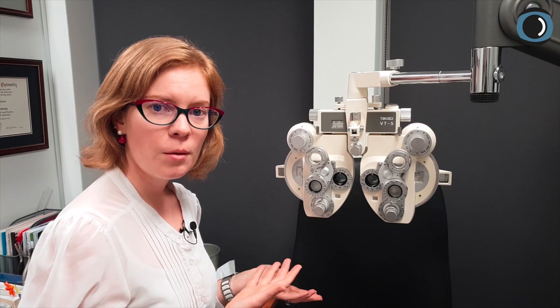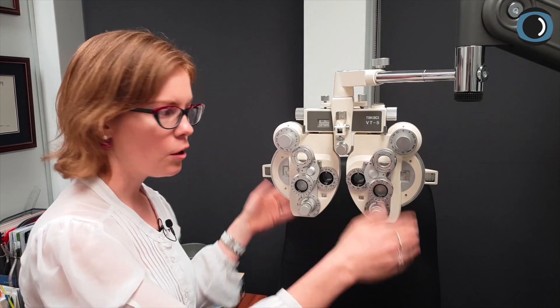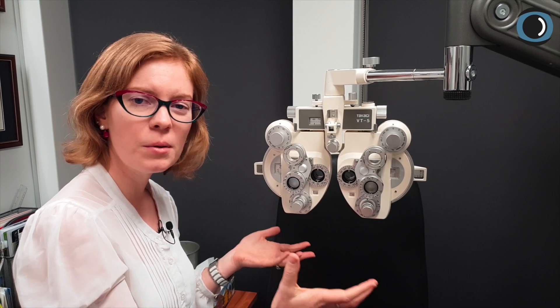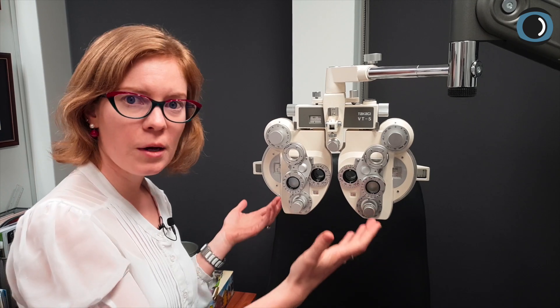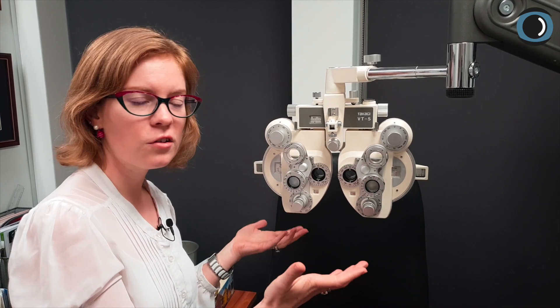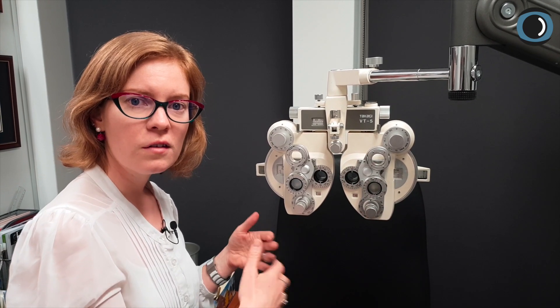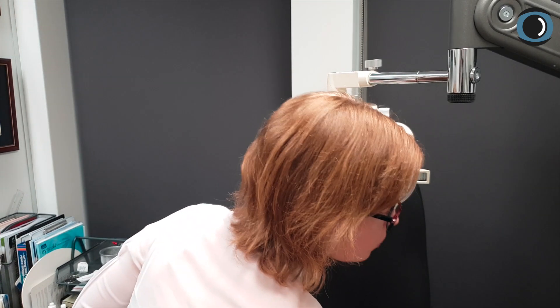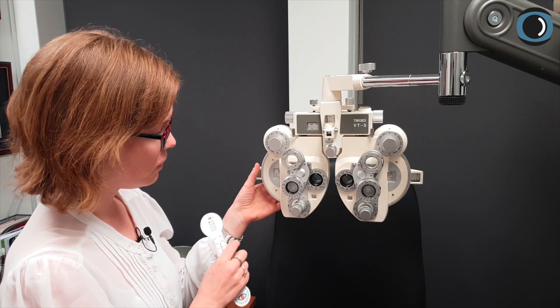Other binocular balance techniques might ask you to blur the patient by plus 0.50 and then ask them to find a difference where there may not be one. You've worked hard on this refraction and there might not actually be a difference between the eyes. So let's give them a difference to see — we're going to put them on the 6/6 or 20/20 line and give them a difference to see.